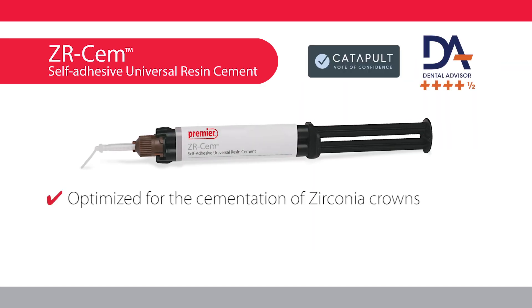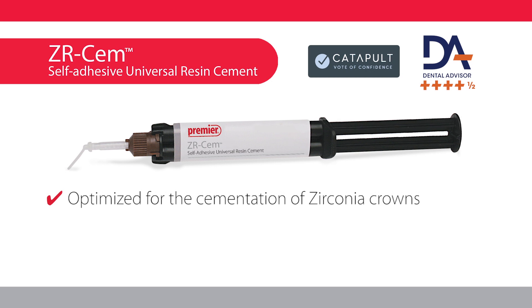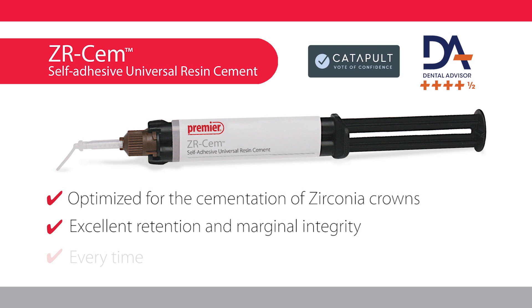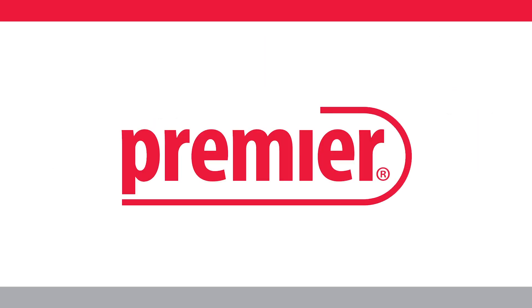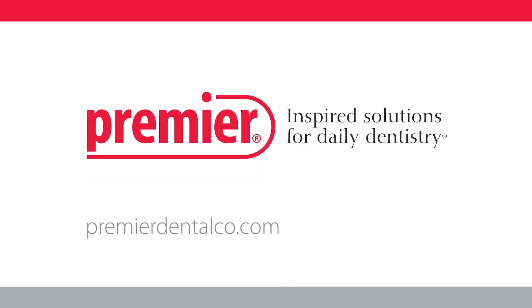Award-winning ZRCEM is the new self-adhesive universal resin cement specially formulated for zirconia. You can count on its long-lasting retention to zirconia, glass ceramics, dentin, and enamel every time. Premier Dental — inspired solutions for daily dentistry.